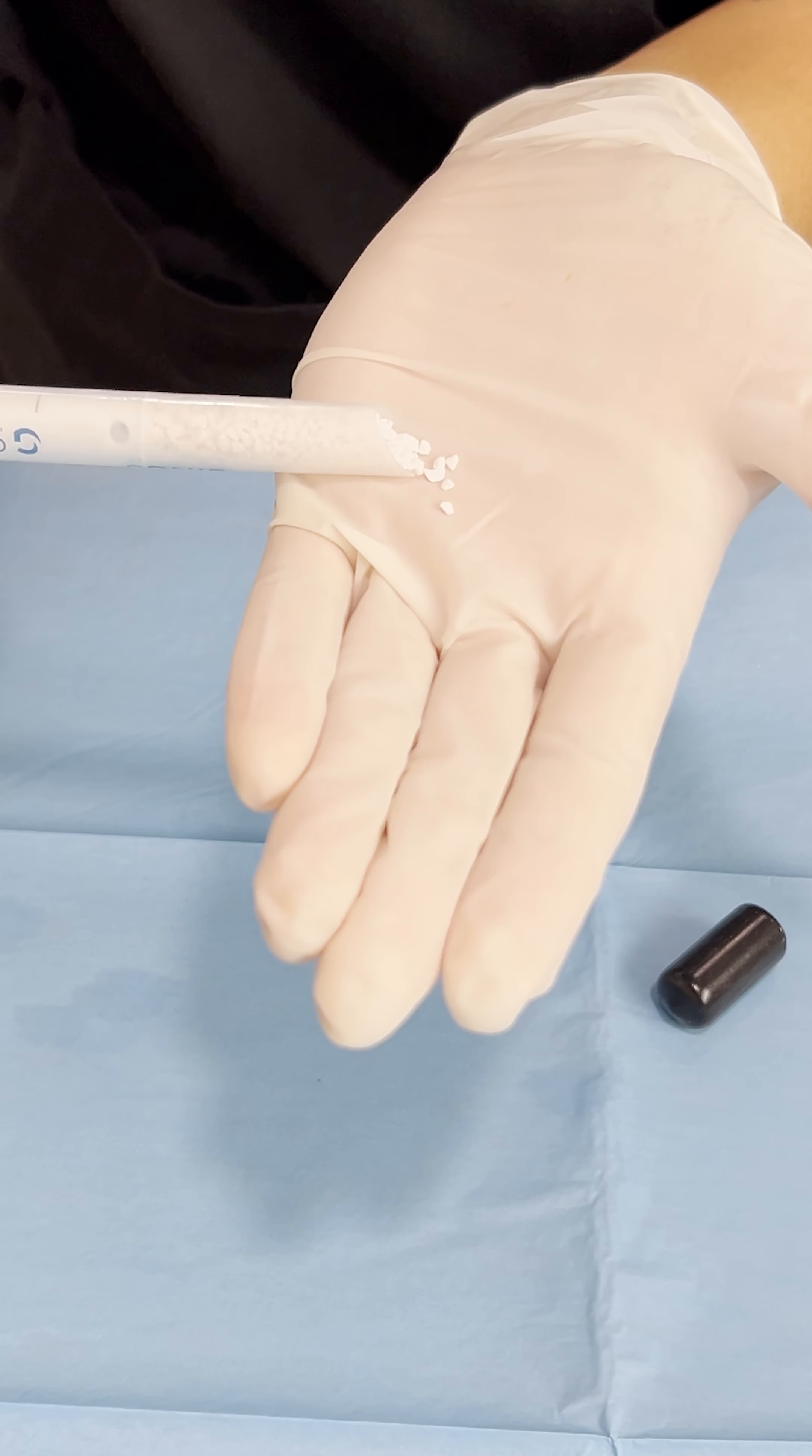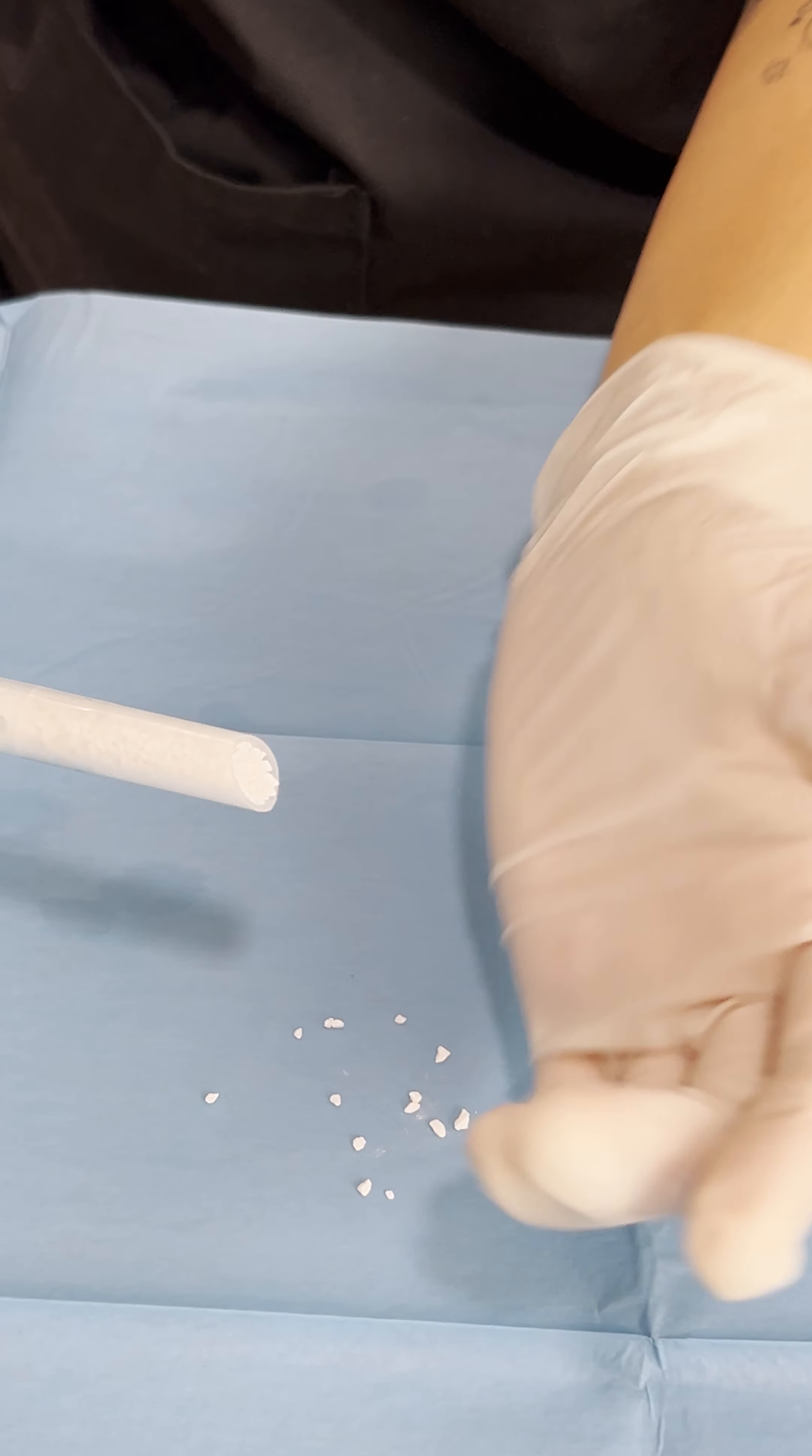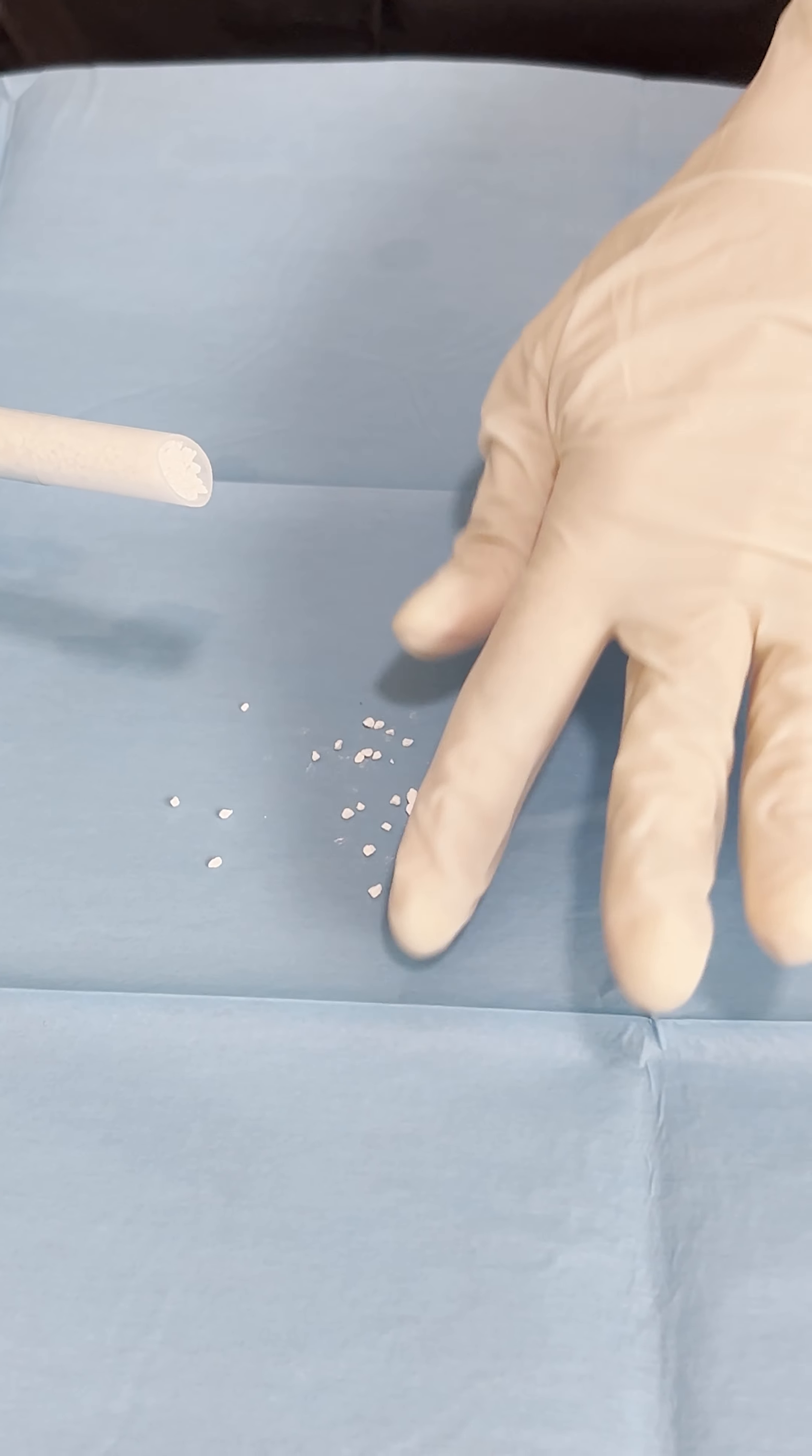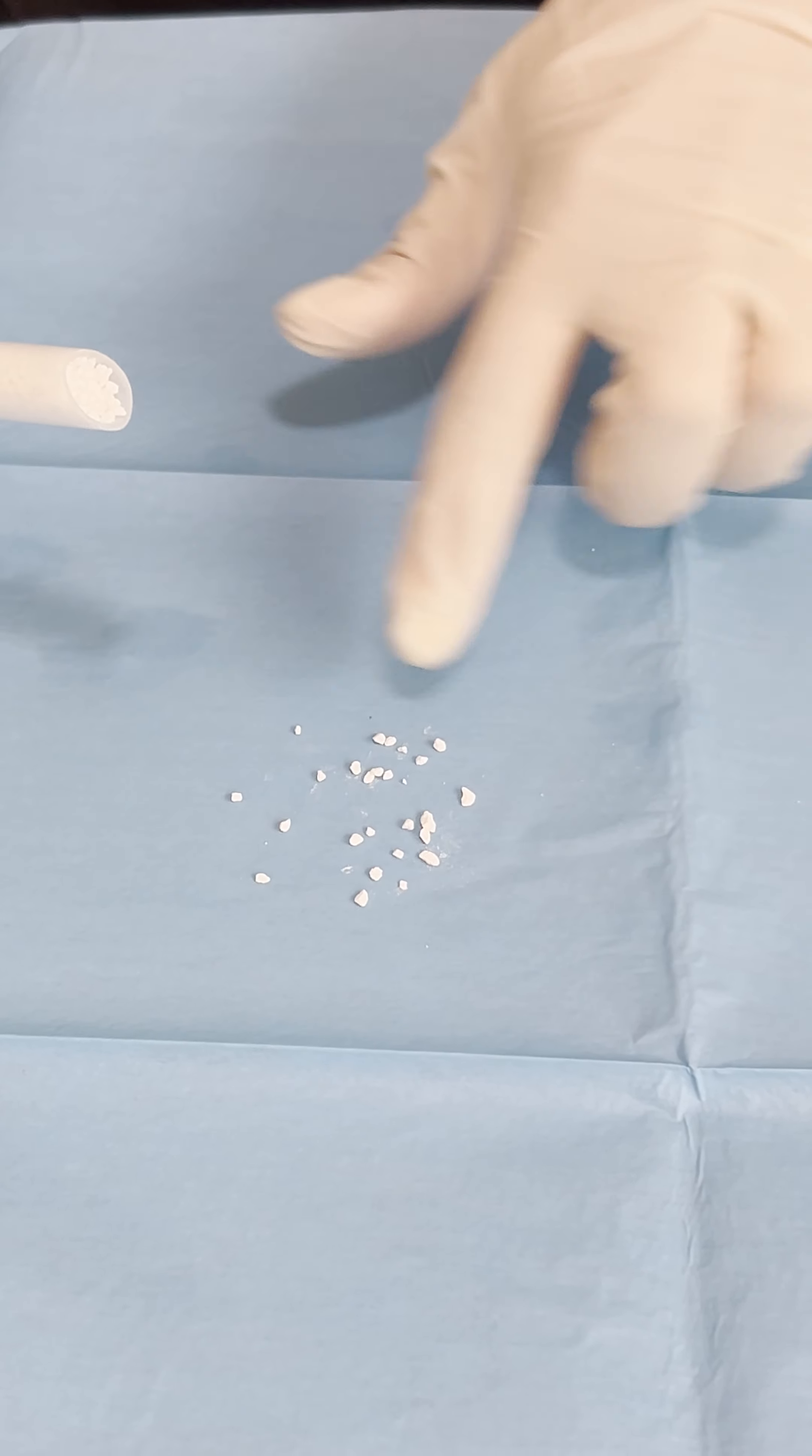Remember that with the respiratory movement, the membrane will suck the biomaterial on the inside. You can also use the same instrument that you use to elevate the sinus membrane. You can see the different size of the granules that go from one millimeter to two millimeters.